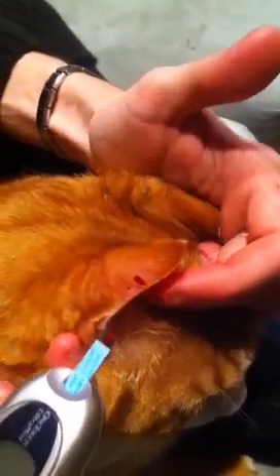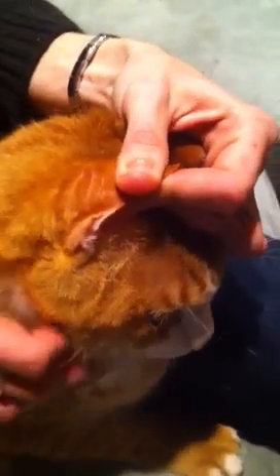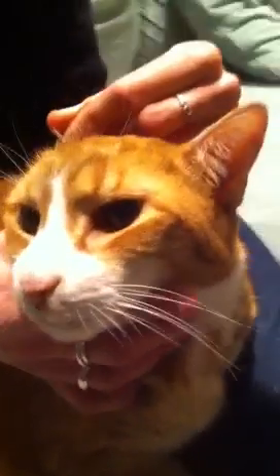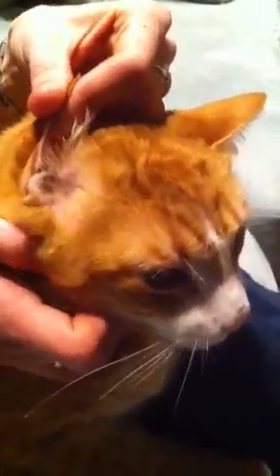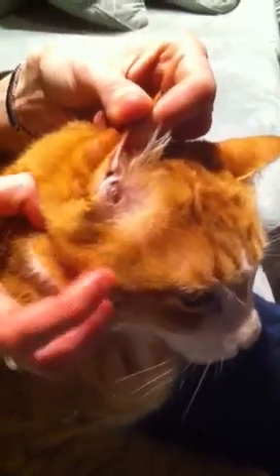Let the drop go onto the strip and hold the ear — and that's it. If you're lucky, your cat will be this good for it, or get this good for it over time, because as you can see it really doesn't bother him. He's purring, he sits still. He has this done to him two or three times a day for the past year.